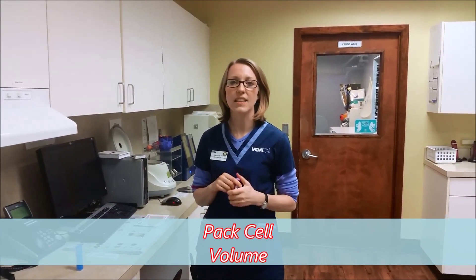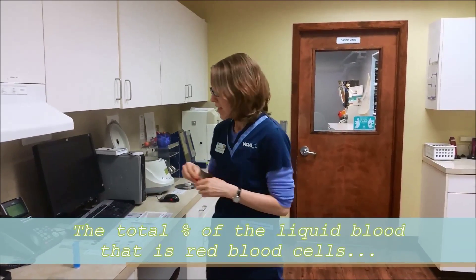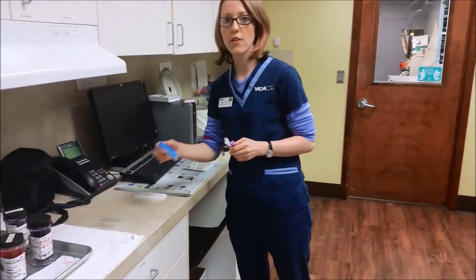I'm going to put my sample in a blood tube so it doesn't clot. Welcome back. So we have our sample, and we're going to be running our PCV and total solids. The PCV stands for packed cell volume, and this represents the percentage of red blood cells in a whole blood sample. So in order to do this, we just need a couple of these micro-hematocrit tubes.